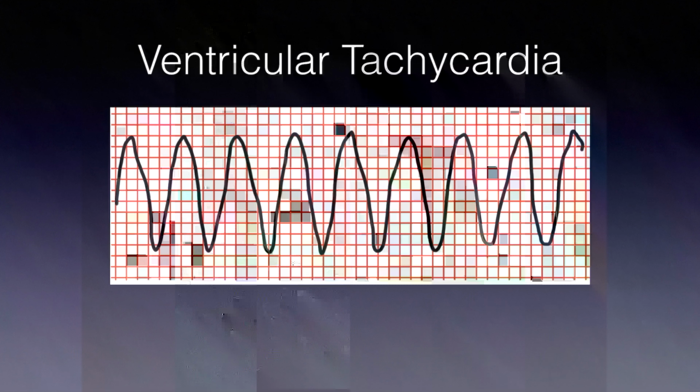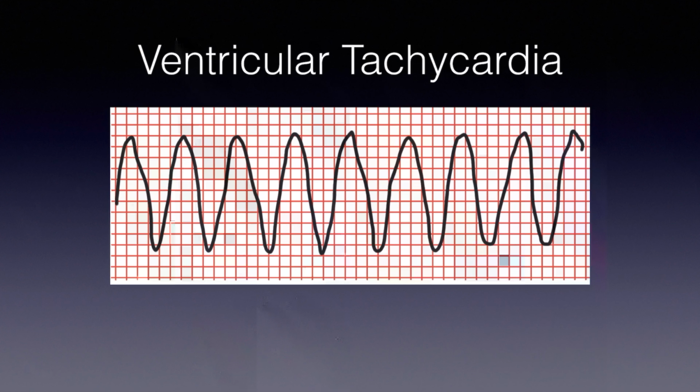And that is the reason why we never put an AED on a conscious patient. Even though they're having chest pains, looking great, having the big one, and you think they're going to go into cardiac arrest at any moment, we don't attach the AED yet because they might be in this rhythm with a pulse, and we don't want to shock someone that has a pulse. But if they are unconscious, unresponsive, not breathing, no pulse, and we attach it and they're in VTach, the AED should recognize this rhythm and shock ventricular tachycardia, just like it would ventricular fibrillation.